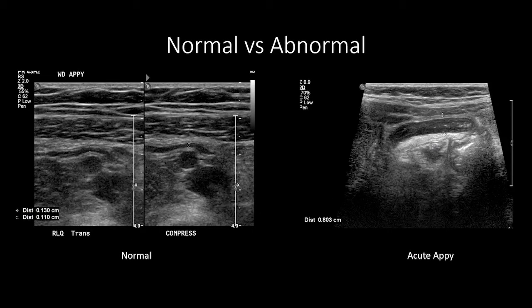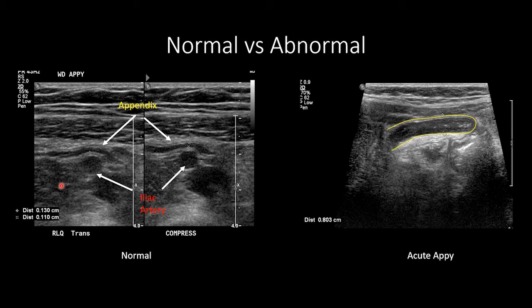Now let's look at a few normal versus abnormal examples. On the left, a case of a normal appendix — we can see the iliac arteries, the appendix overlying the iliac, and the psoas muscle. This appendix measures only about one to two millimeters, which is very impressive to visualize. On the right, an appendix that is substantially larger, measuring a diameter of eight millimeters, consistent with acute appendicitis on its own. In addition, we see an area of very echogenic fat adjacent to this appendix, again representing inflamed fat stranding.